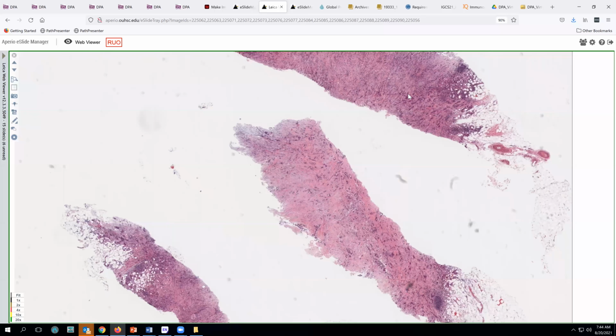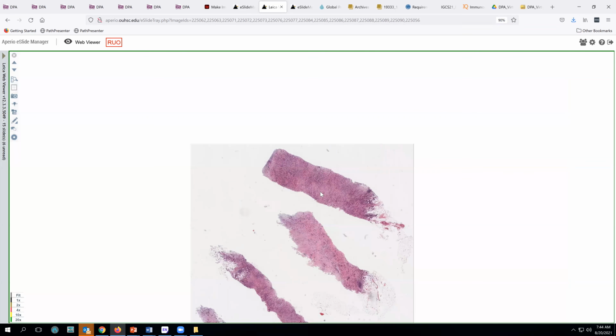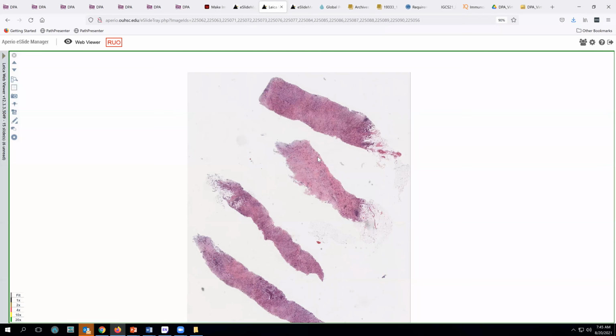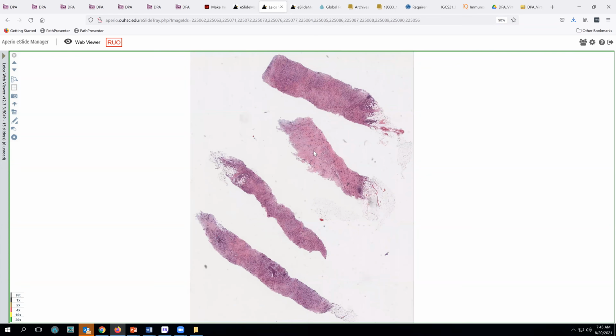And I will mention here that it's important to correlate the morphology that you're seeing with those hormone and breast marker studies, because what you don't want to do is be scoring something as a mitotic score 1 on H&E histology, and then have the Ki-67 come back at 80%. That would indicate that you're probably not validated in terms of your mitotic counting. But if you've got something in the 8 to 20% range, that would certainly be okay for a mitotic grade 1.